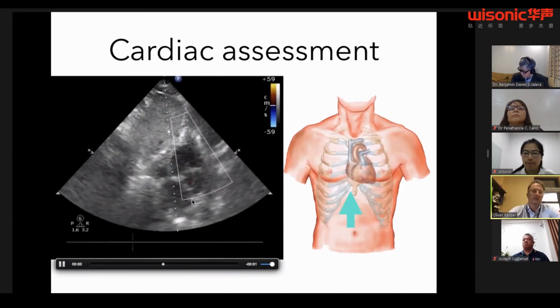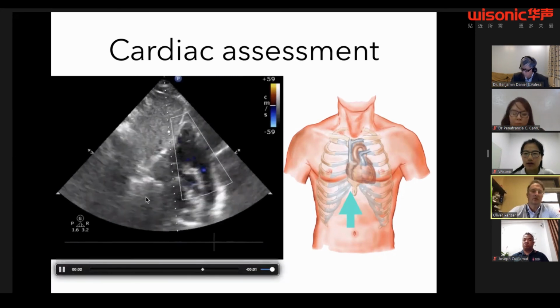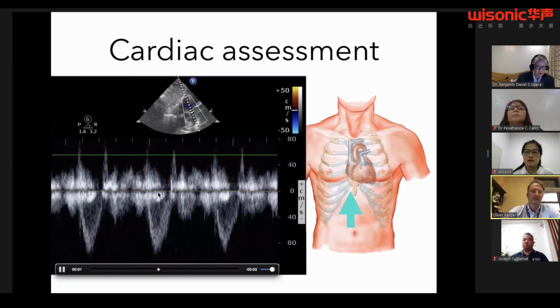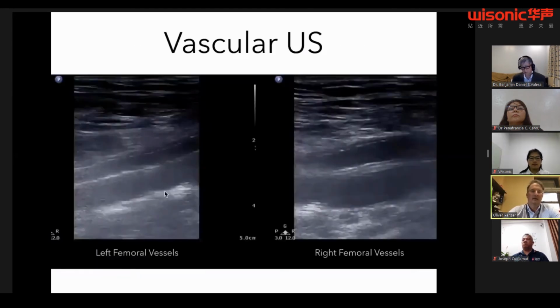This is way too advanced, but I'm just showing it because we did it. We used color Doppler to see where the flow is, and we looked at what the stroke volume is of the RV. And you can see here the stroke volume signal. This downstroke, it's nice and broad, and it has a good velocity. So very suggestive, you could do this in more detail, but it would go beyond this, of a good RV stroke volume.